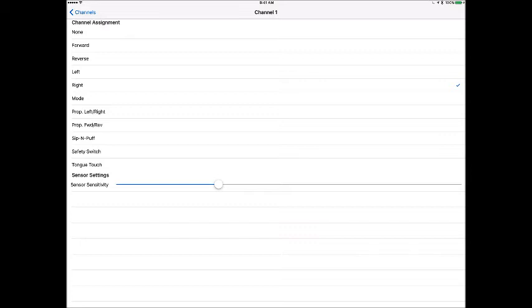So now you're not worried about getting into a different function. You might have created a stop of the chair, but now you might be in your seating functions, or you might have stopped the chair, but now you're into a different type of speed function. Depending on how you're programming your chair, if it's not programmed as the stop switch, you could also just change your speeds instead of stopping the chair, or turn off the chair automatically, which isn't good for the motors.